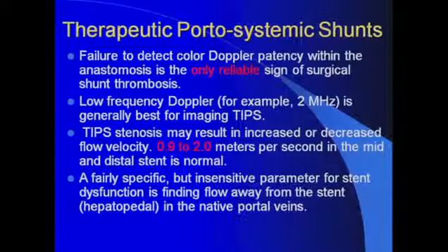So the advice is to not evaluate those prior to 48 to 72 hours from the time that they were put in. So what do you use to evaluate these TIPS?